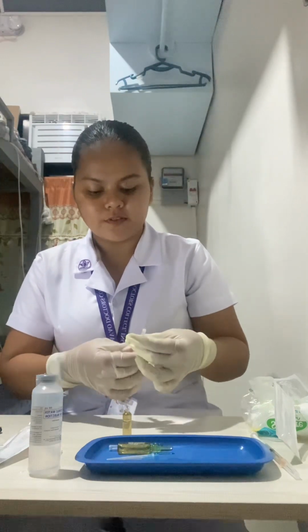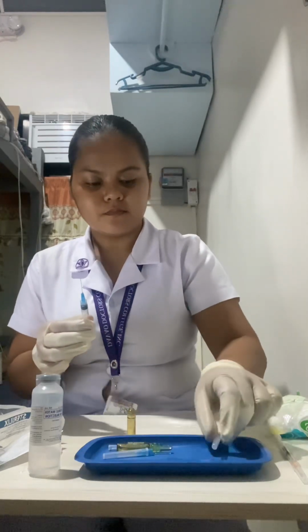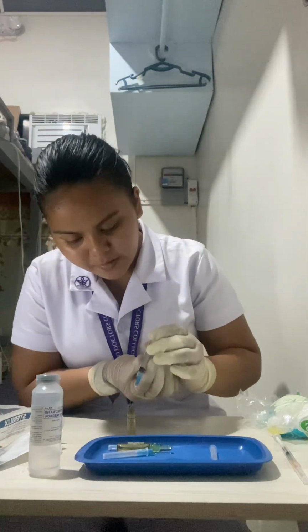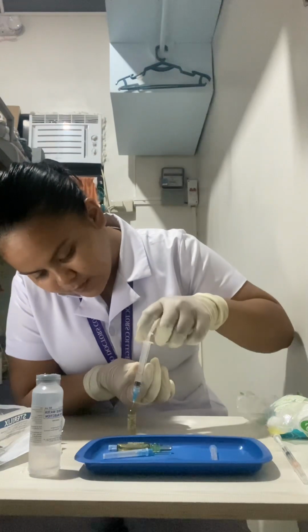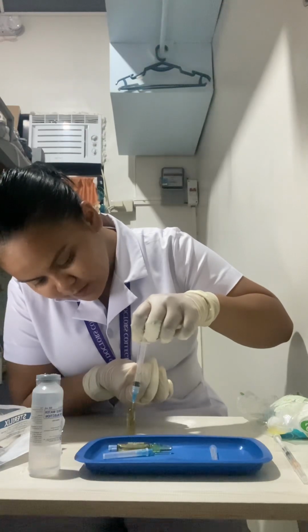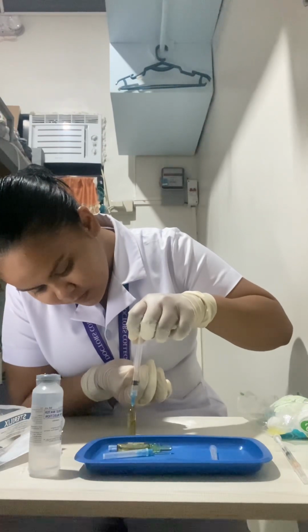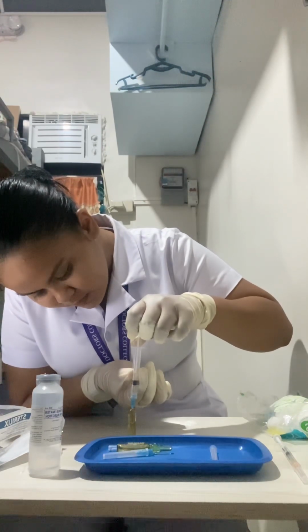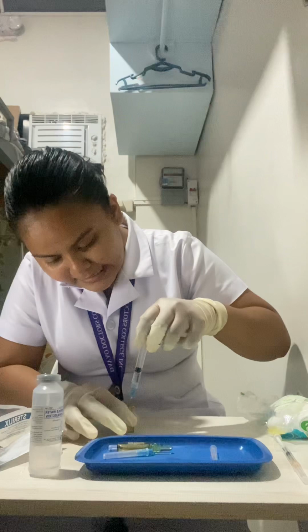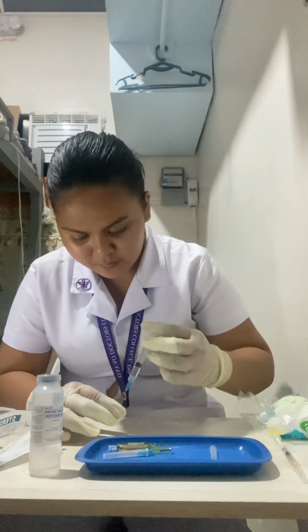So I have to make sure that the filter needle is attached. And now I'm going to remove the cap of the needle. And then I'm going to withdraw the medication that is prescribed gradually, making sure that I do not inject air into the syringe. We can slightly tilt the ampule so that we can withdraw all the medication.